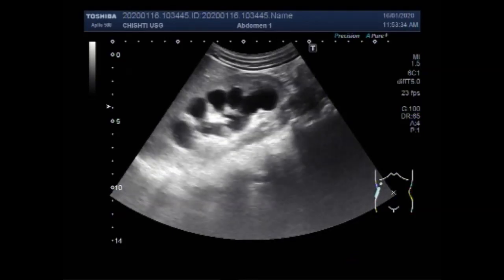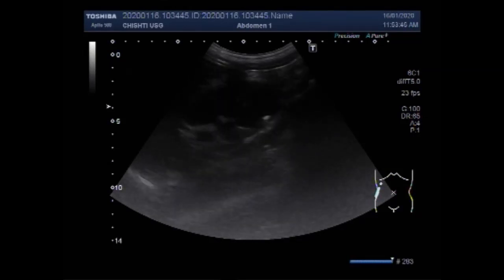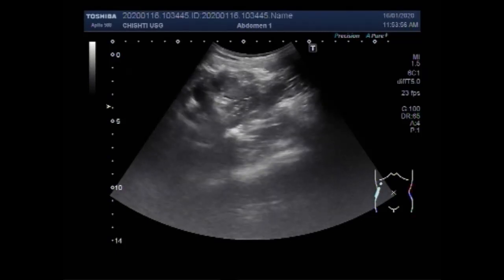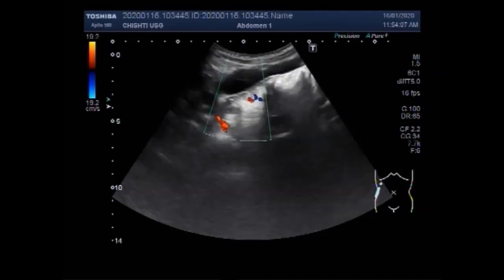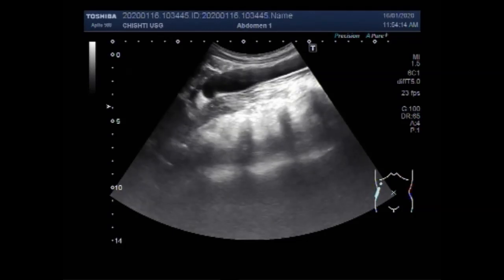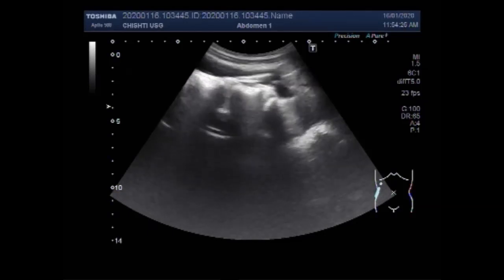Now you are going to see the focusing of the ureteric stone. The focusing of the ureteric stone requires a bit of probe handling, and you can use the color Doppler to differentiate between the blood vessels and the ureter. You can see the ureter in its upper one third.